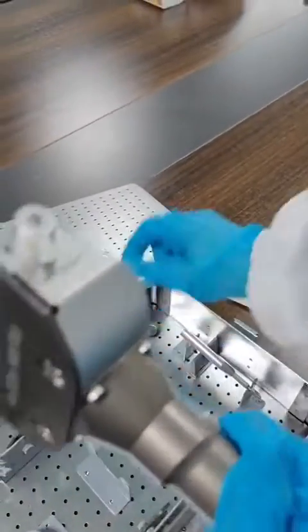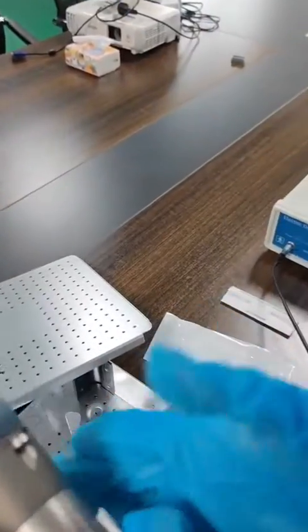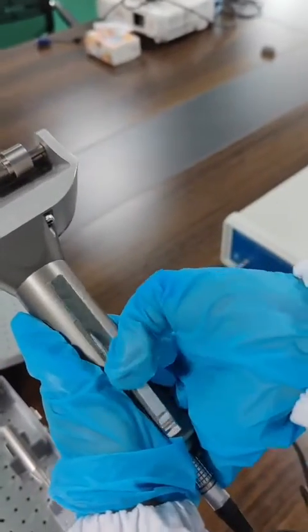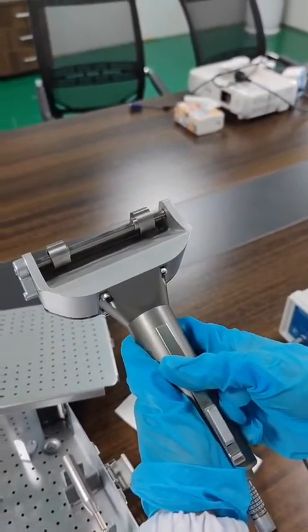Adjust the thickness. Turn on the power supply. Press the switch. Now we can peel the skin.